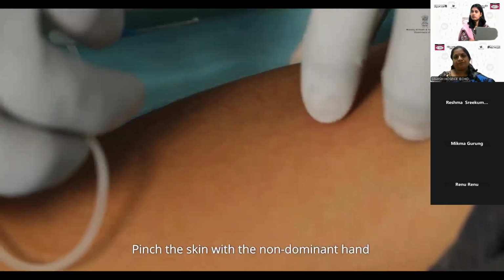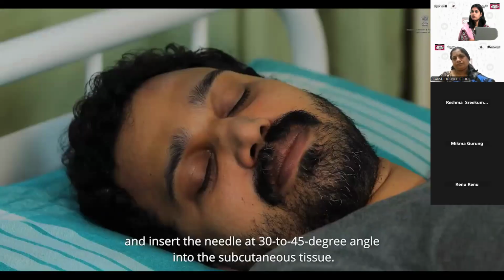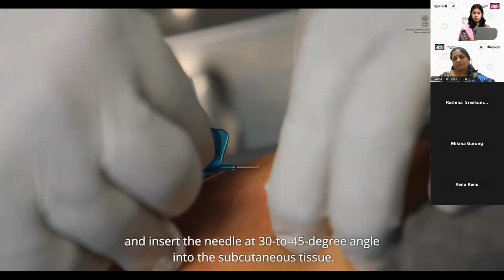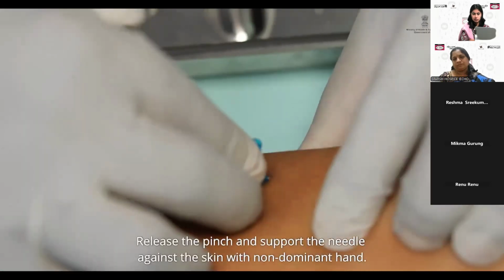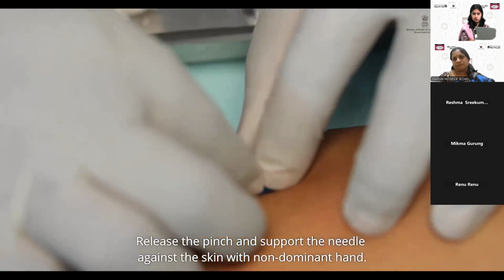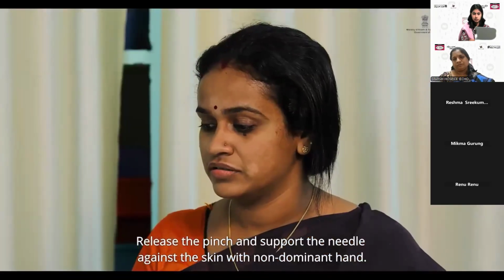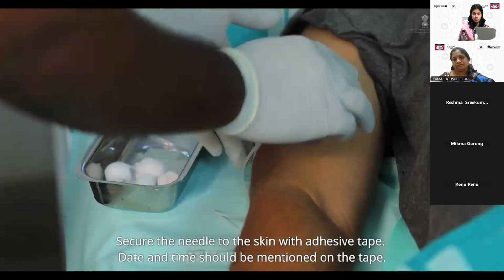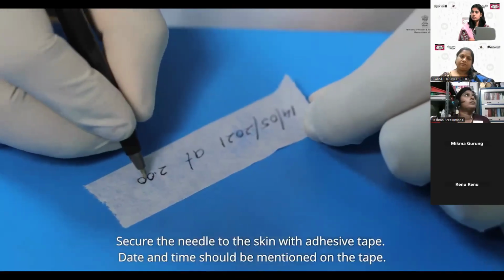Pinch the skin with the non-dominant hand and insert the needle at 30 to 45 degree angle into the subcutaneous tissue. Release the pinch and support the needle against the skin with the non-dominant hand. Secure the needle to the skin with adhesive tape. Date and time should be mentioned on the tape.